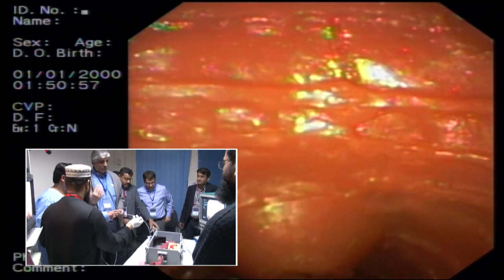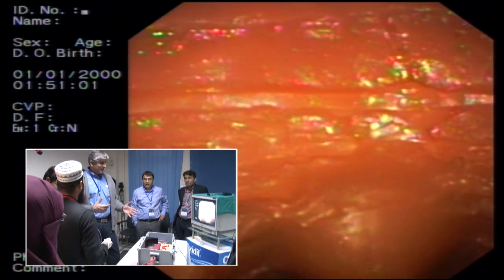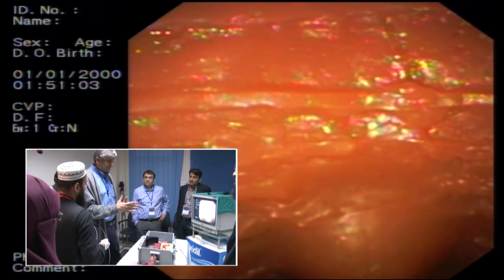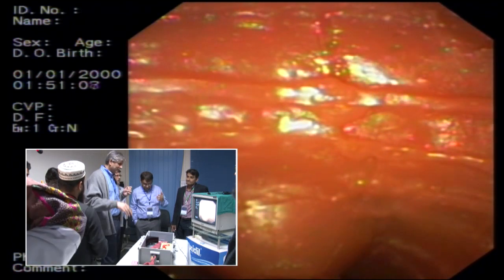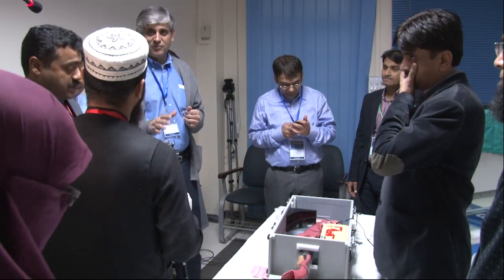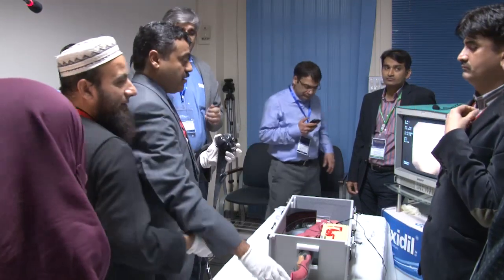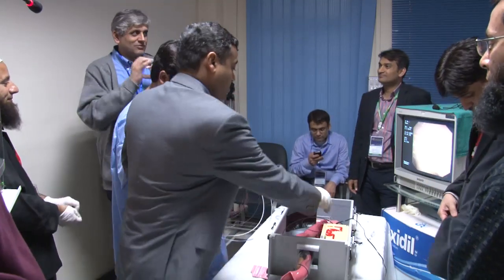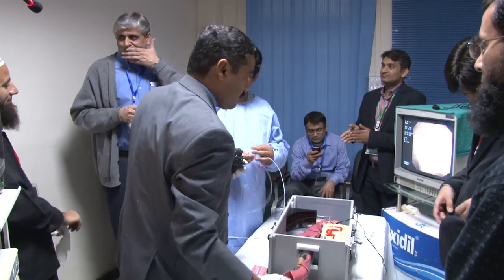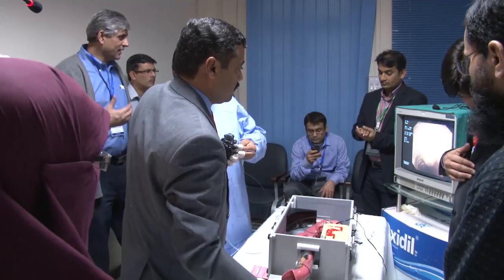communication between him and you, ये तो आप डमी पे कर रहे हो आसान है. If you are stuck and your stent is not going up and you are talking to him, forget it. It's not the fault of the stricture, it's not the fault of the scope, it's not the stent, there's nothing. It's the lack of communication. If you have a good tech, he will actually guide you and help you through.